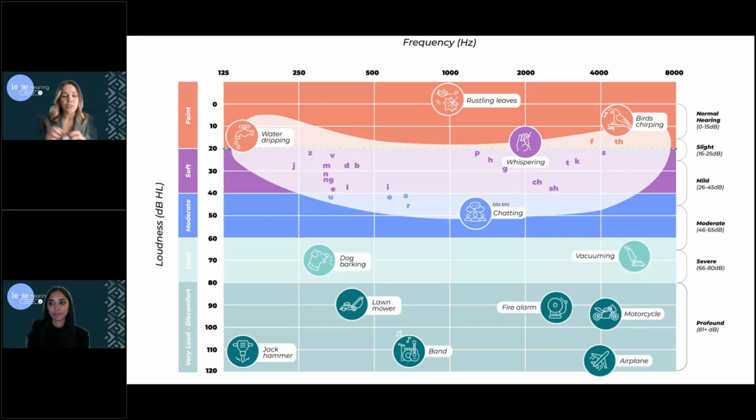Okay. Most people have hearing loss that tends to be worse in the higher frequencies. 85% of people have a mild to moderate hearing loss. All right. So a lot of people have trouble. They can hear people talk, but they can't always understand what's being said. And over-the-counter hearing aids are specifically designed for mild to moderate hearing loss. They help us capture all of those important speech sounds, especially when we're placed in difficult environments where there's multiple people talking, where there's background level noise.